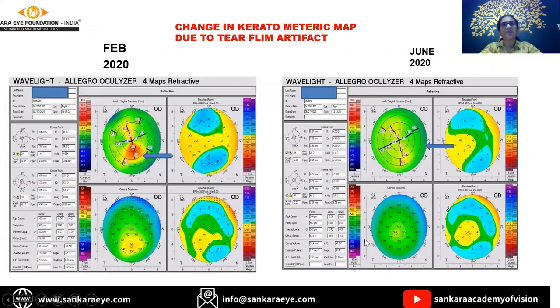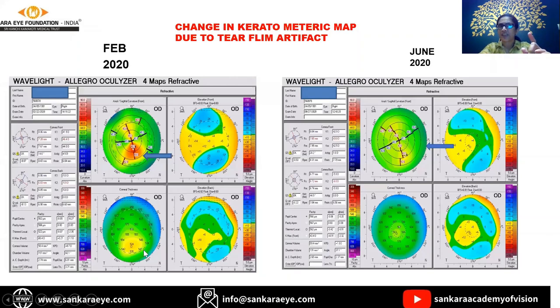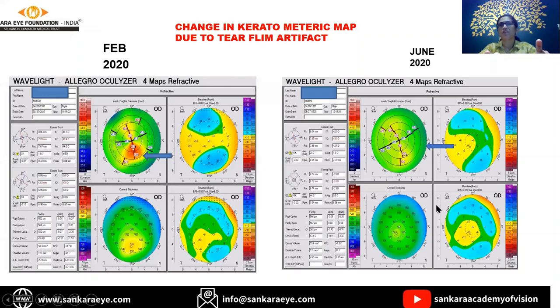Next case: this is the patient's picture from February 2020, showing an isolated island of steep cornea. The anterior elevation, posterior elevation, and pachymetry are otherwise normal. Whenever you see only one isolated hotspot with no other parameters abnormal, have a suspicion of an artifact. This patient had a tear film artifact and after treatment over three to four months showed absolutely normal topography. Do not always assume red means pathological - check if it is truly pathological or an artifact.